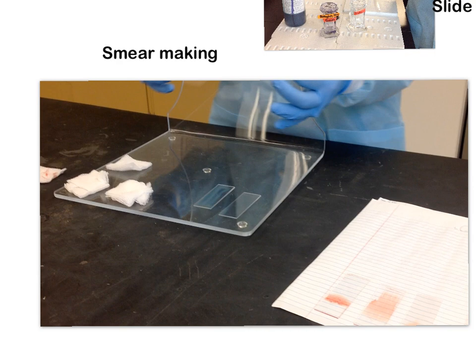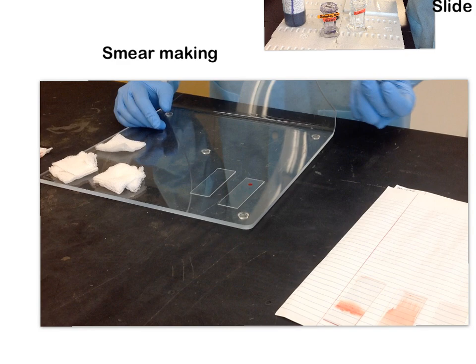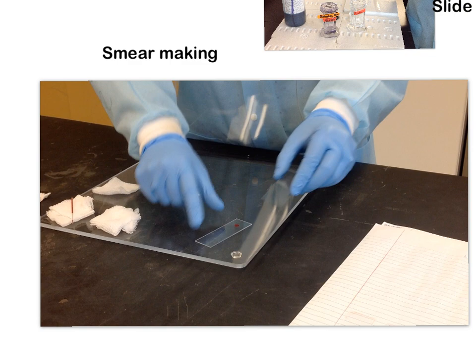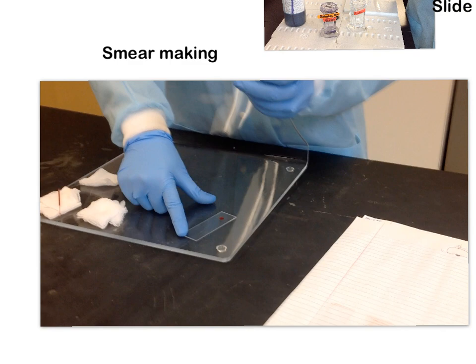When you start making smears, I recommend you don't try to make more than one at a time because you'll have too many things to think about. Start with one. Put just about a 1 to 2 millimeter drop of blood about an inch up from the end of your specimen slide. Grab your spreader slide — you can hold it with one finger on the end, or however feels comfortable for you.